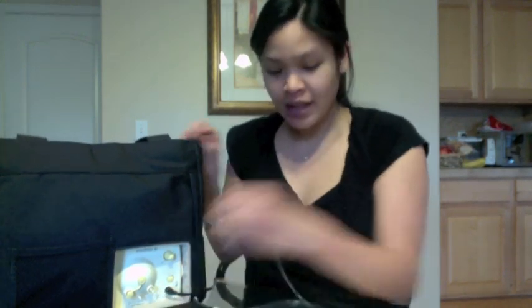into warm soapy water and go ahead and wash it, or if you want to use the Medela micro steam bags, those are really good at cleaning it, or you can boil it like me. I soapy wash everything and then I boil everything again, or I use my microwave steamer thingy. I'm a little bit OCD about germs right now, at least until she's 3 months, especially since it's winter time. But yeah, and then again with the valve, make sure to pull straight out, and then you can go ahead and put everything back in your bag and set it up to use it for next time.